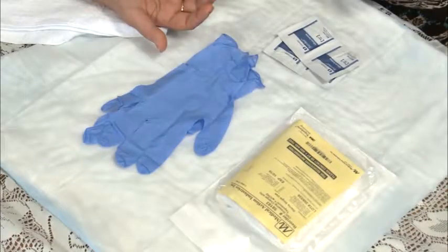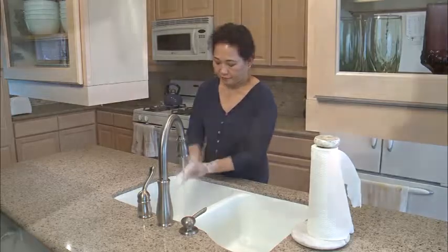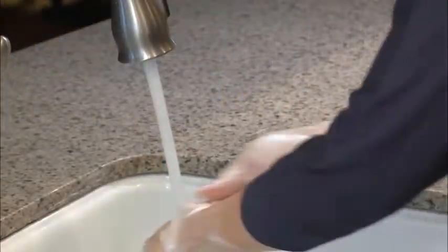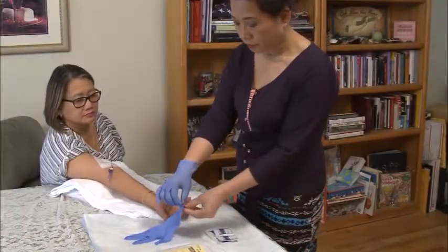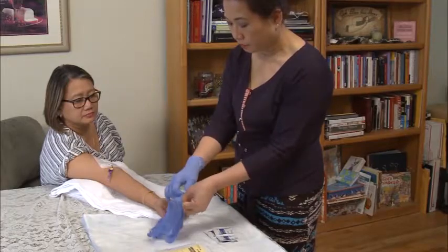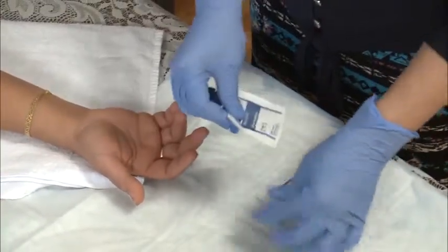Make sure you have all your supplies. Wash your hands briskly for a minimum of 15 seconds. Dry them with a clean towel. Place a clean towel under your arm or shoulder. Wear non-sterile gloves. These gloves come in a box, much like tissue paper.